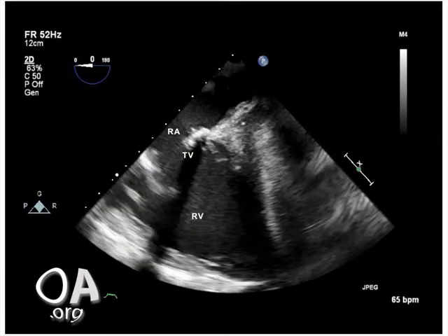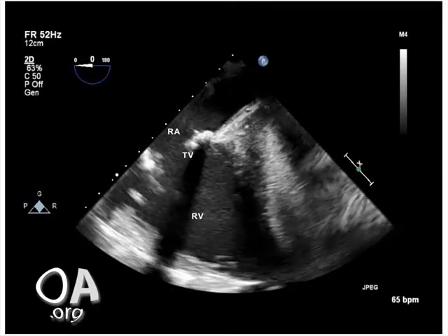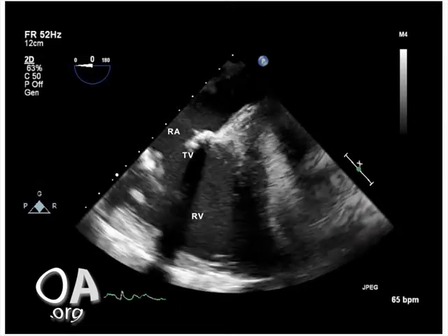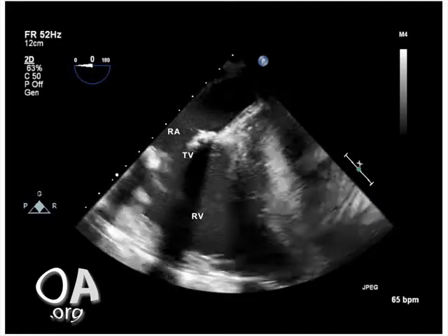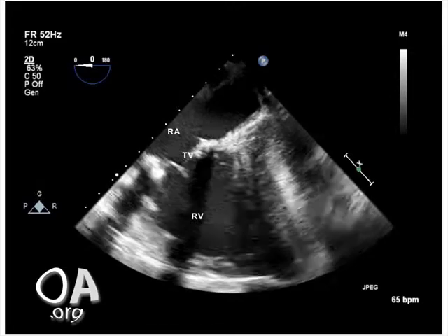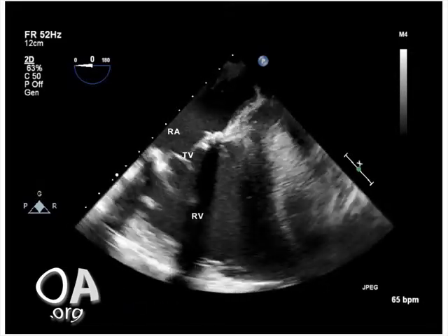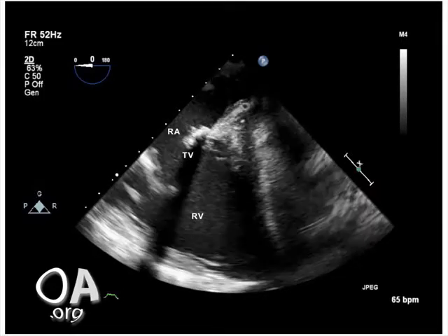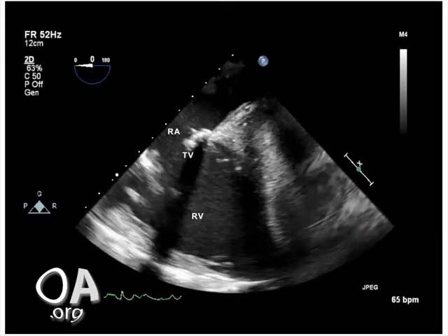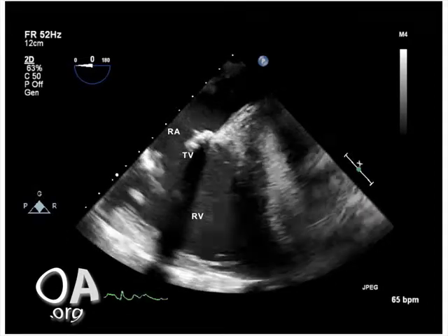This is a postoperative TEE in the midesophageal location, 4-chamber view with the TEE probe rotated slightly clockwise in order to focus more closely on the right heart structures, including the right atrium, right ventricle, and the new tricuspid valve prosthesis. Echolucent streaks shadowing down from the tricuspid valve prosthesis are an artifact due to the new valve structure.